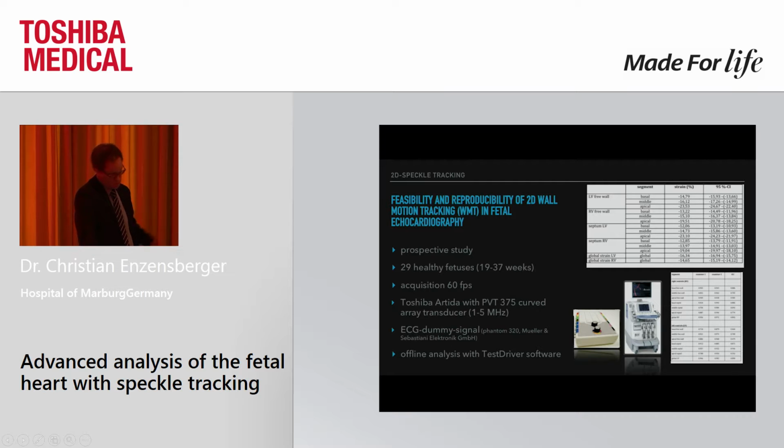What we can reproduce in a very good manner is that there is a basal to apical ongoing longitudinal strain. We have the lowest strain values in the basal parts and the highest longitudinal strain in the apical parts, and this is something which we also know from adult echocardiography.